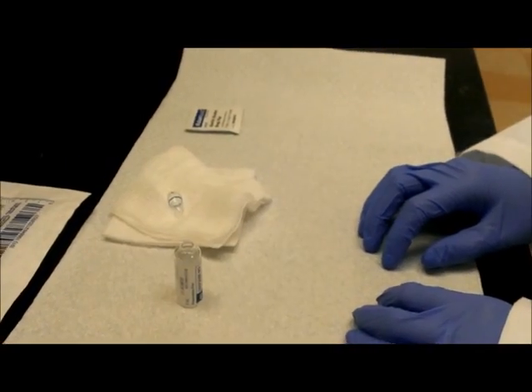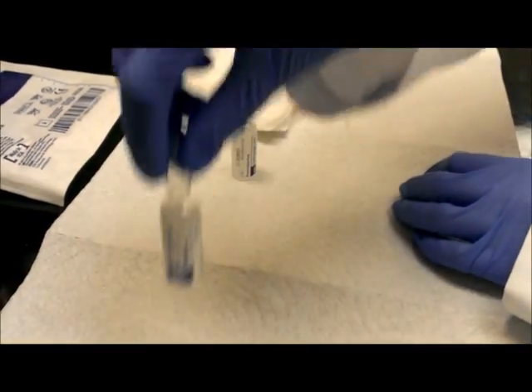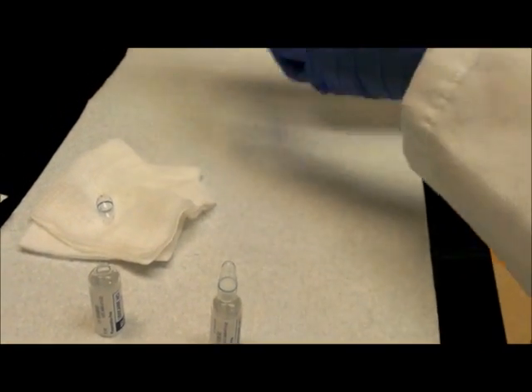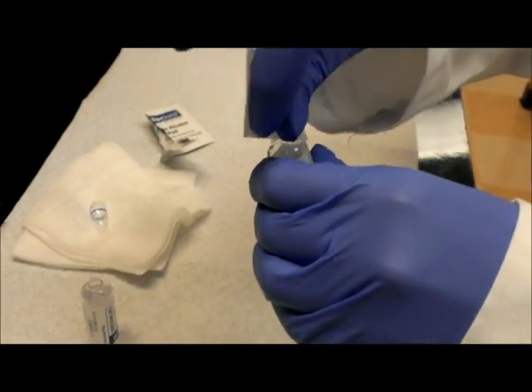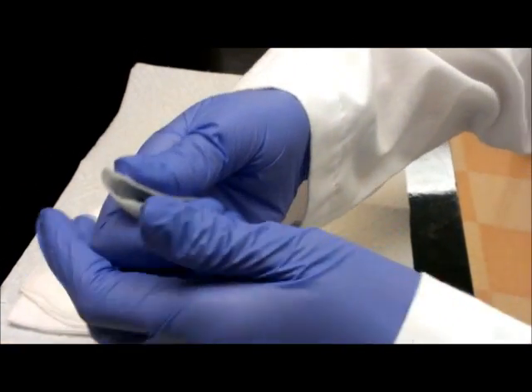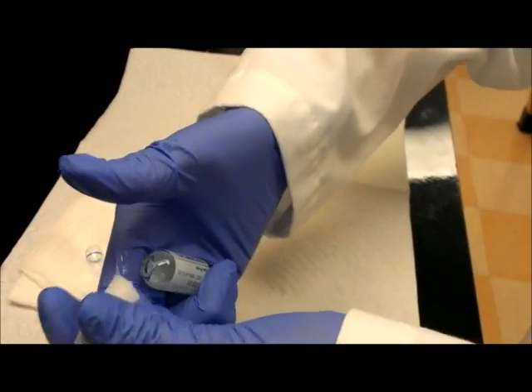The second technique is to just use an alcohol swab. You do the same thing as you did with the gauze. After wiping the neck of the ampule, you simply hold the alcohol swab over the neck and push firmly. The alcohol swab is more slippery so we don't recommend using it.